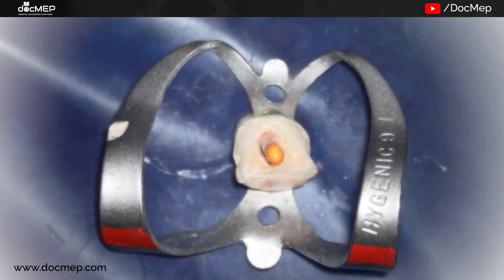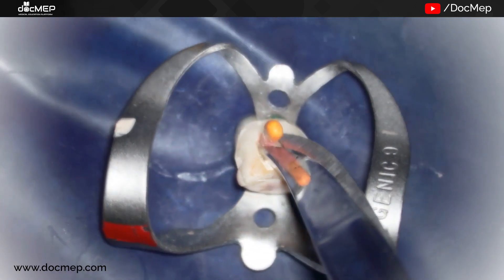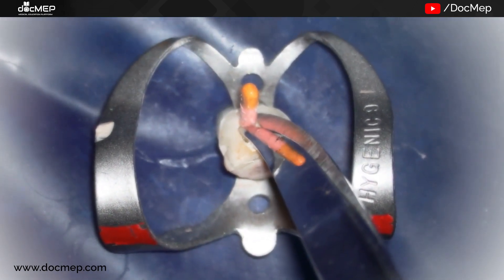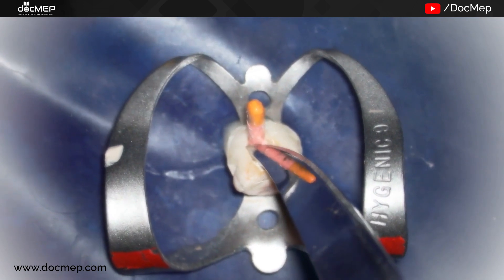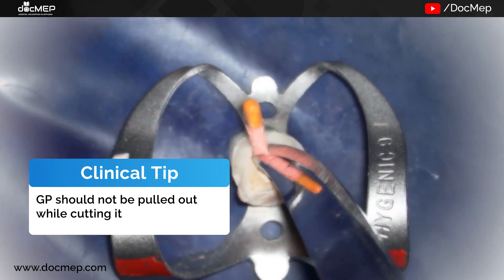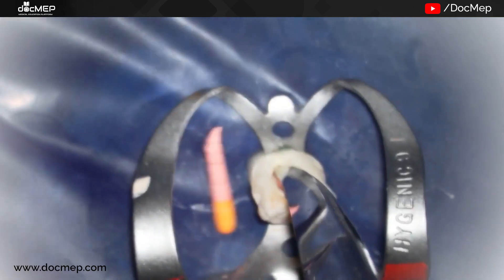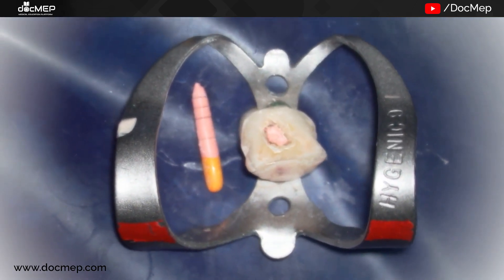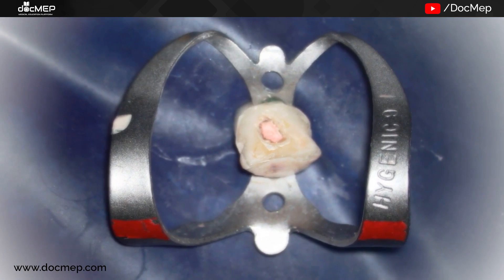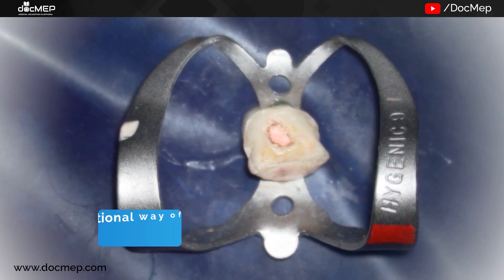The next part is cutting the extra GP out. We take a fine scissor to cut the excess hanging outside the chamber, making sure the GP doesn't get pulled out, as that would repeat the whole process. Finally, we seal the orifice with a heated instrument — the most popular method is to take a heated ball burnisher and sear the GP in the orifice.